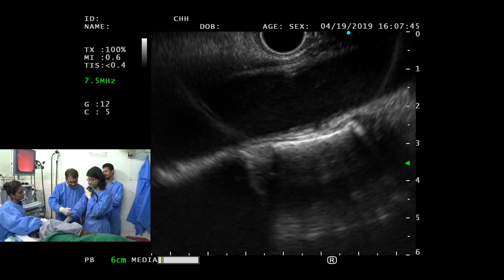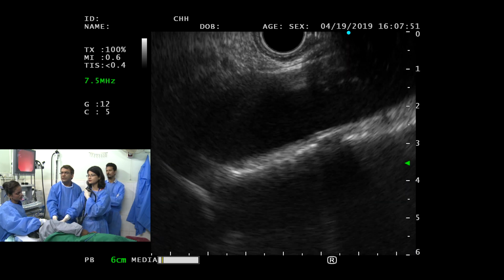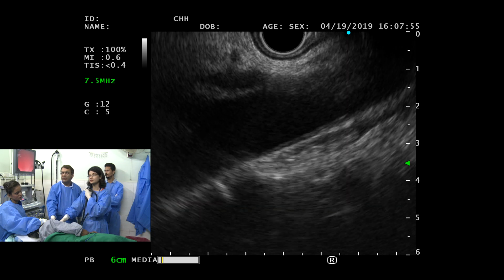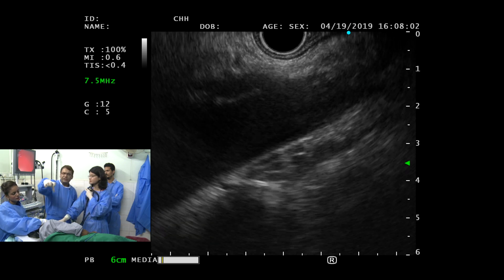You need to come closer, yeah. I need to push, and the goal is to keep and maintain the celiac position so that I can see the celiac. You see the celiac, right? Sometimes the scope gets hung up on a hiatal hernia or the gastric folds.